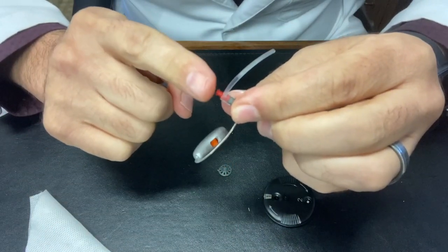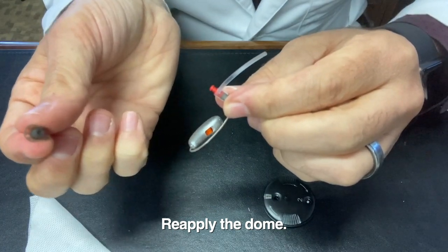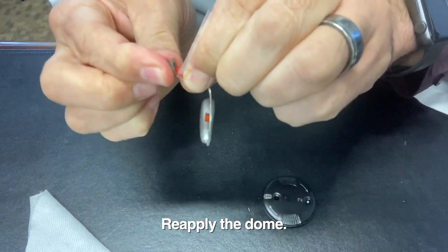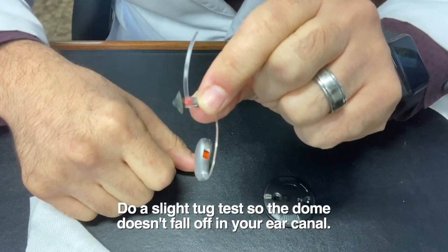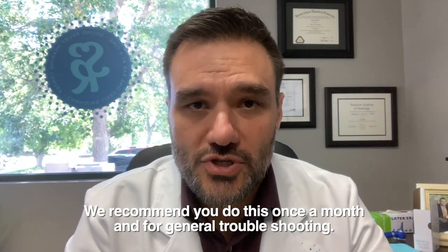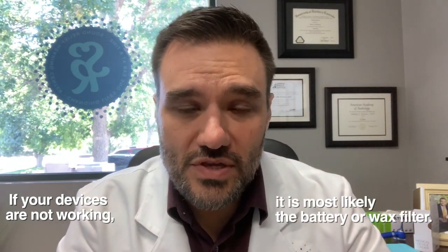Then it's time to put the dome back on. I take my dome and look on the underside because there's a little grommet there, and I just want to wedge this right back onto the device — just like that. You can do a little tug test to make sure that it's not going to pop off in your ear canal. We recommend that you do this approximately once a month or for general troubleshooting. If your devices are not working, chances are it's either the battery or the wax filter. If you need help with either of those things, please give us a call. Have a great day. Thanks.